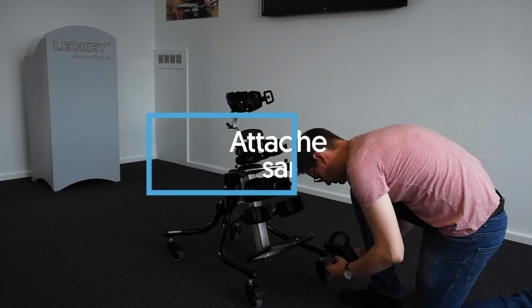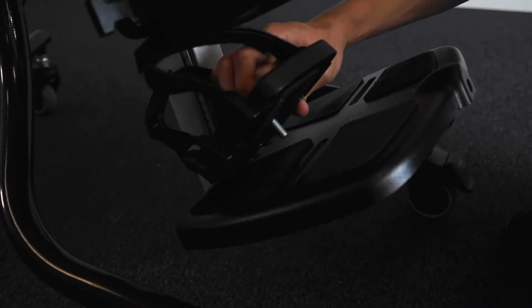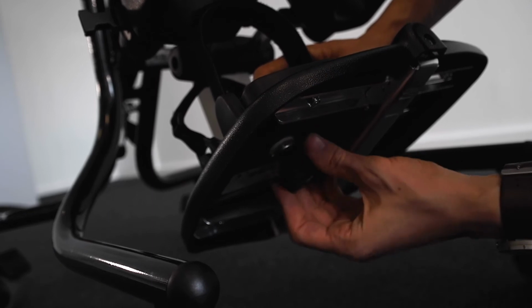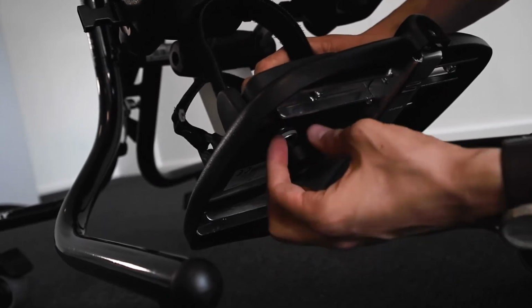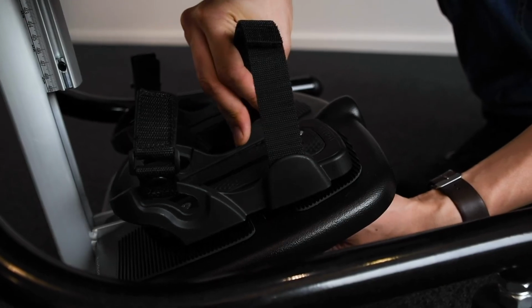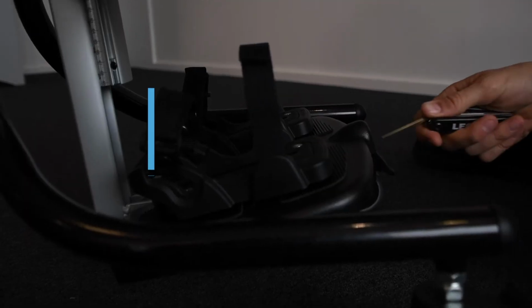Attaching the sandals. Place the sandals so that the attachment bolt goes through the slot in the footplate. To secure, on the underside of the footplate, place the rubber washer, followed by the metal washer, and then the knob onto the attachment bolt. To position the sandals, simply loosen the knob under the footplate, select the position you require, and refasten the knob.